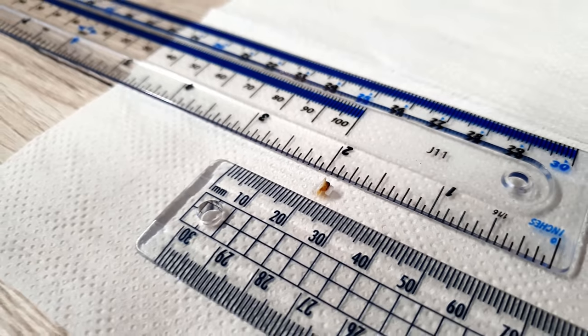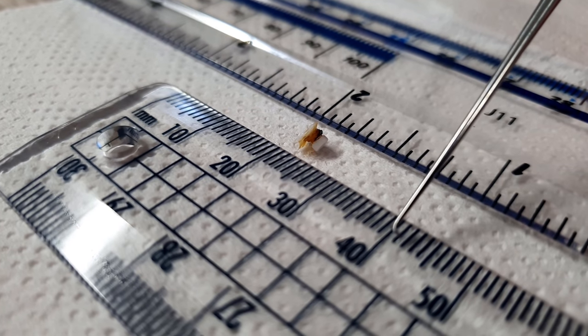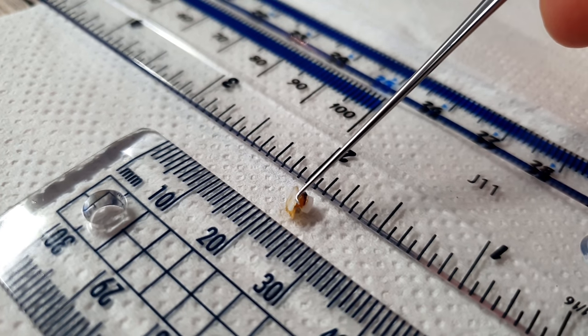The roof of the middle ear, called the tegmen tympani, is a fairly thin piece of bone separating the middle ear from the brain, so it is a very worrying condition and will have to be removed surgically. I can't see any cholesteatoma there at the moment, despite having tilted the endoscope to have a look, but this is a job for ENT.